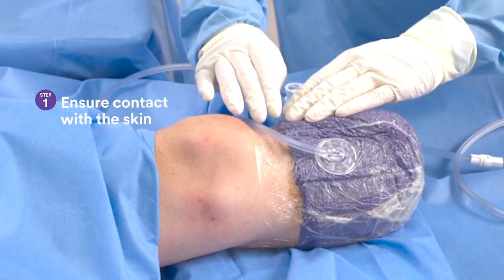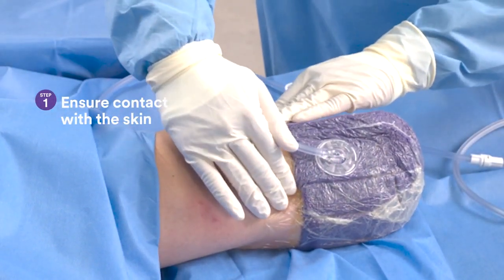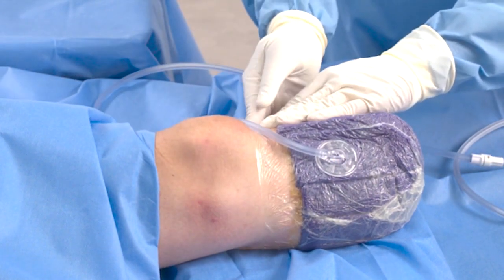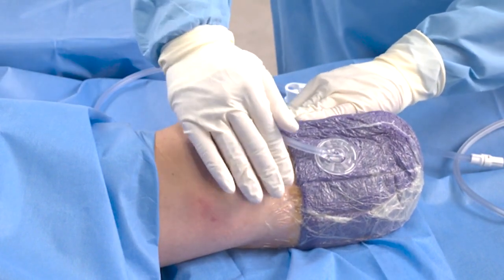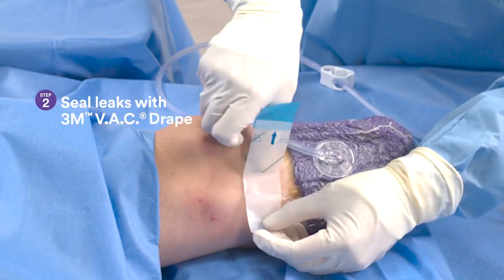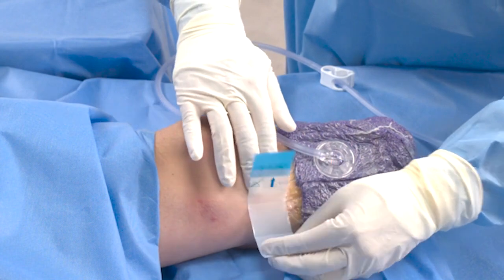First, with the therapy unit on, press down through the drape onto the adhesive seal all the way around to ensure the seal. Use your fingers to smooth out wrinkles or creases. If you identify a leak, use excess vac drape along the outer edge of drape to seal leaks.